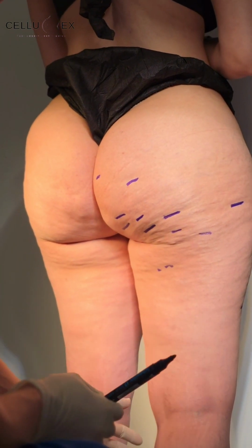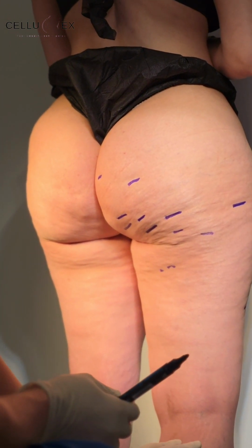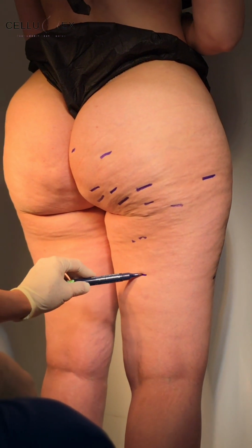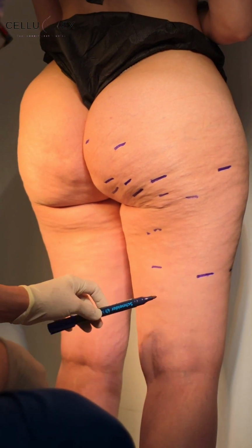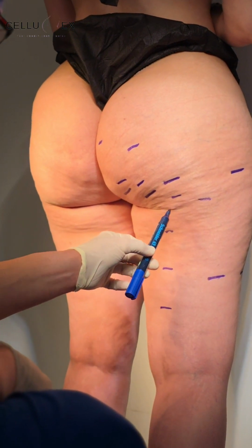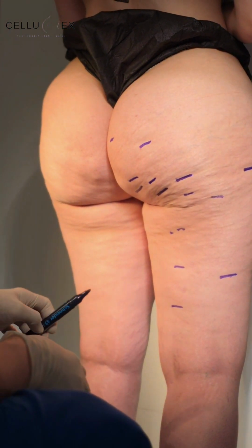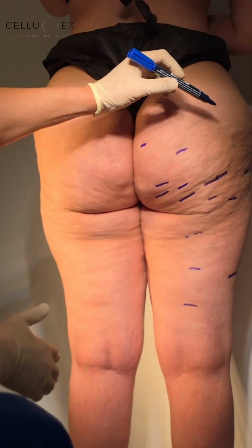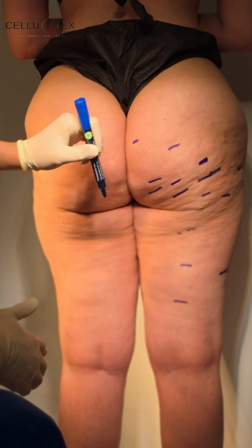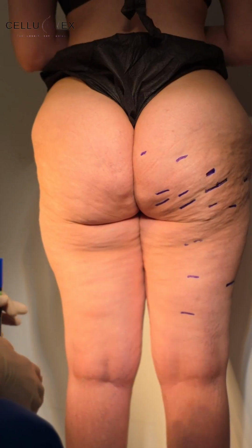For the posterior thigh, you would ask the patient to put her legs backwards, so you would see the cellulite fibers. You would see some here, and there is one here. We might be able to reach it if we do our incision in the crease here. So we took another angle where you can see the cellulite also better. This is another one. Now we'll turn to the other side.